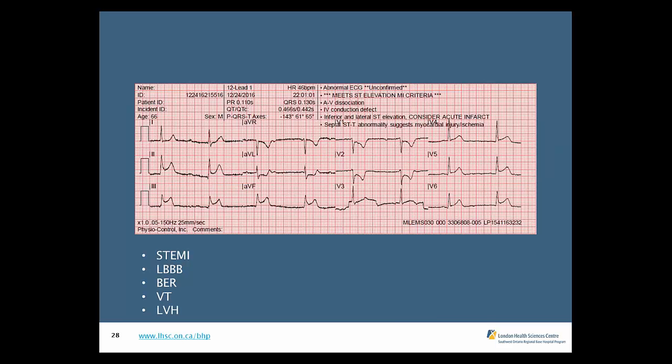Any other thoughts there, Matt? You good with that one? That's an excellent job. Yeah, we have 85% identifying that as STEMI there. Again, looking at this, there are definitely the reciprocal changes we'd expect to see.